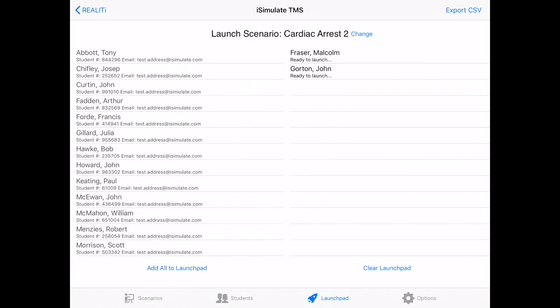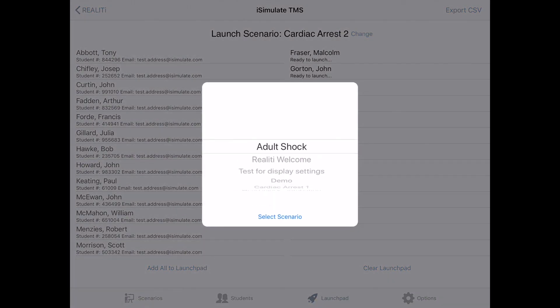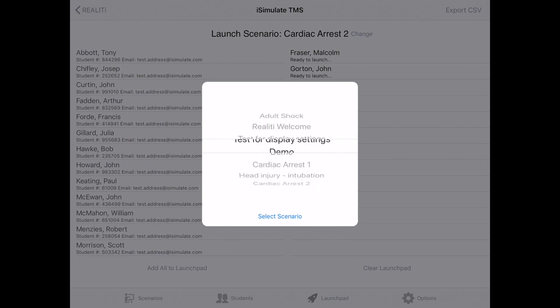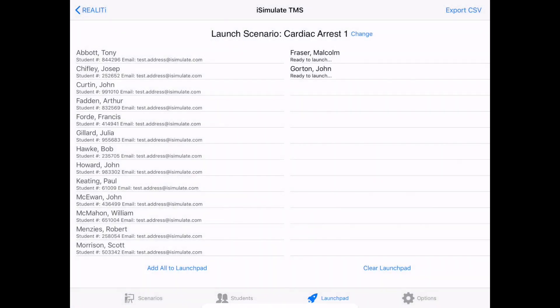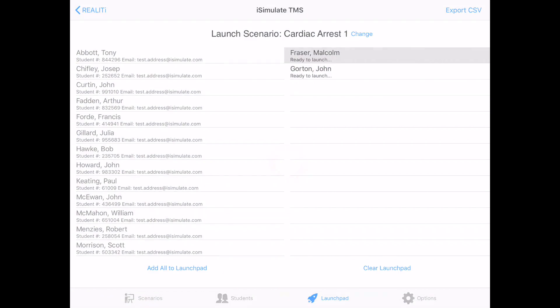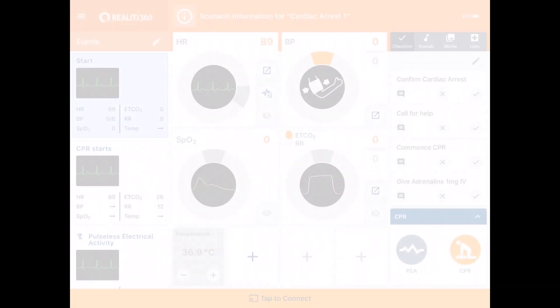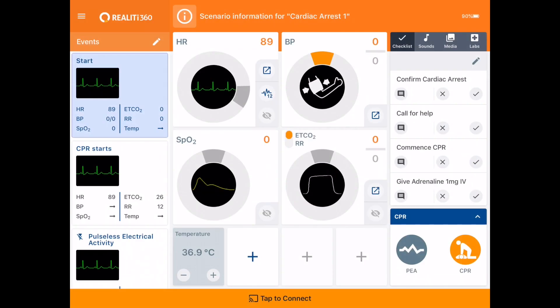Now, in the top part of the screen, you can see the launch scenario. So I can change this by tapping on change. And then I can choose the scenario that I want these students to run. Let's pick cardiac arrest one. Now we're ready to launch. So we tap on one of these students. And this now opens up into the main control screen and we can run the scenario from here.